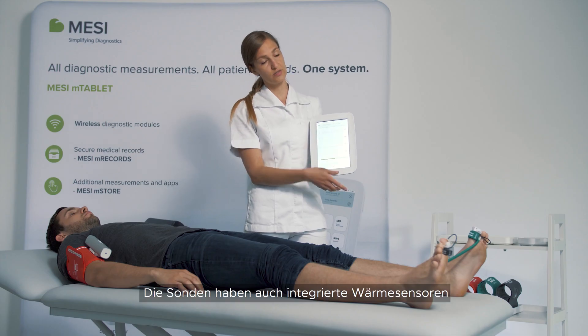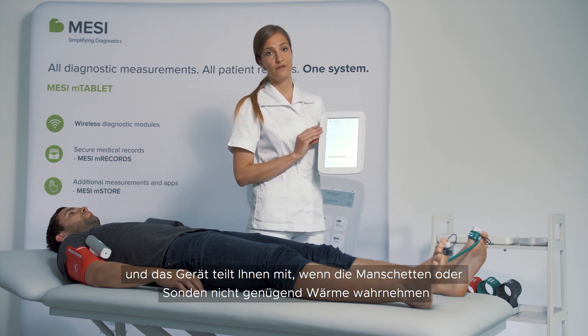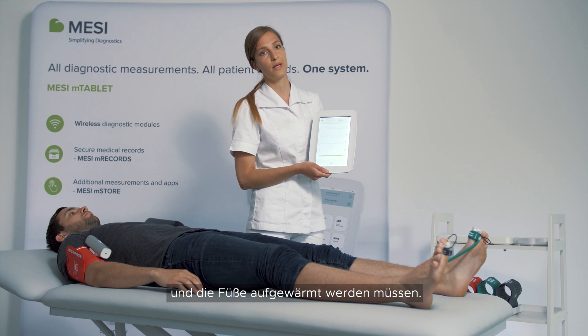The probes also have integrated heat sensors, and the device will let you know if the cuffs or if the probes are not detecting sufficient temperature in the feet and they need to be warmed up.